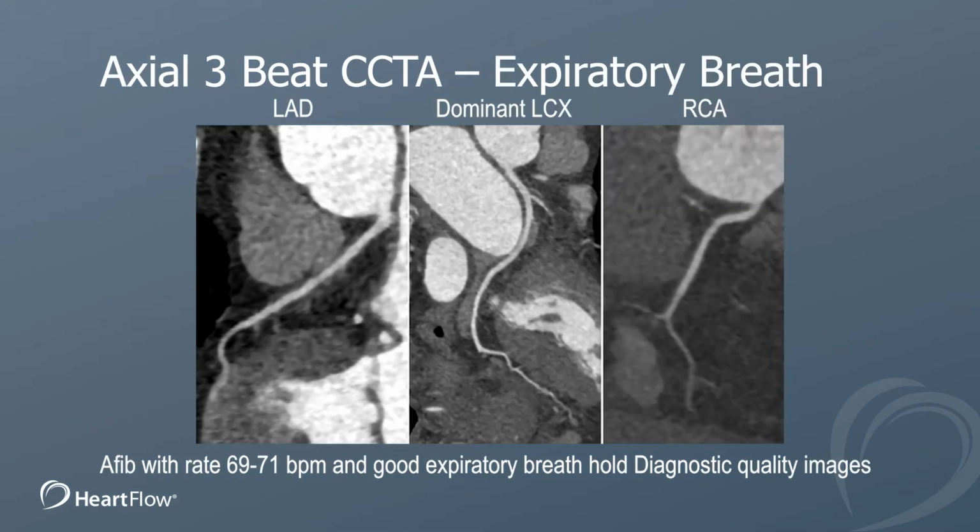As a consequence, we got excellent diagnostic images on this patient with no misalignment artifacts, and you can see the image quality is good even though the patient had atrial fibrillation on this scan. Because this patient held their breath well, we got excellent images on this 3-beat axial sequential acquisition.